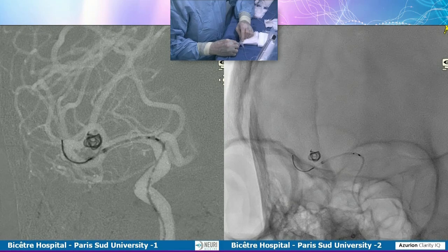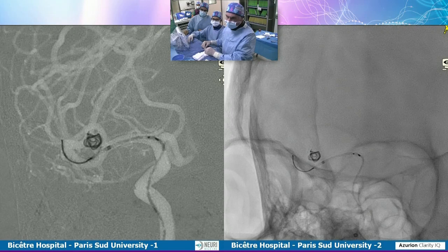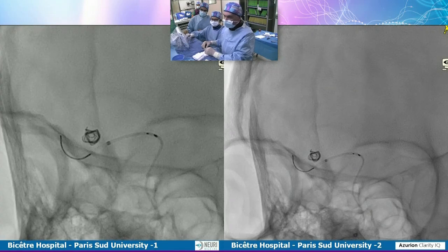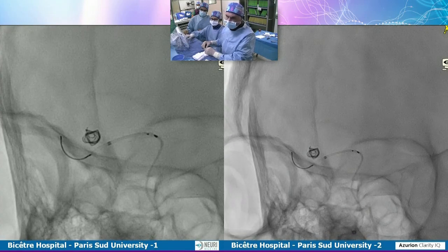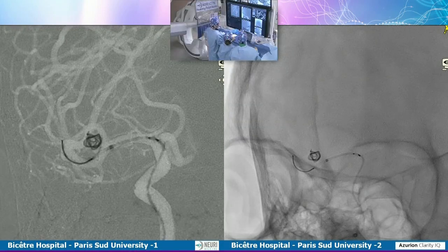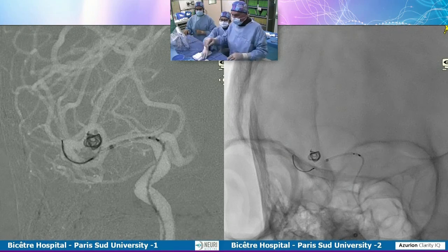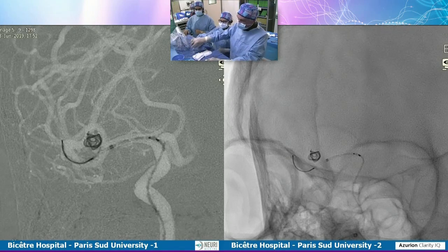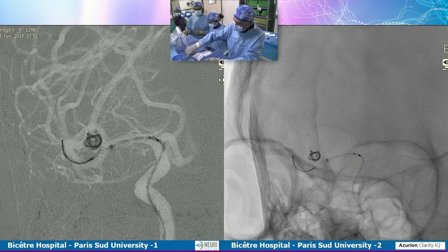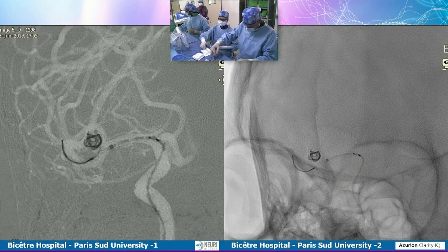You have the sleeves which are attaching the distal end of the pipeline. So you have to continue to unsheath. Now it's opening. You have to keep an eye on where you want to land. Of course there is a straightening of the anatomy. So you have to do another control angiogram to be sure that you are landing exactly where you wish.